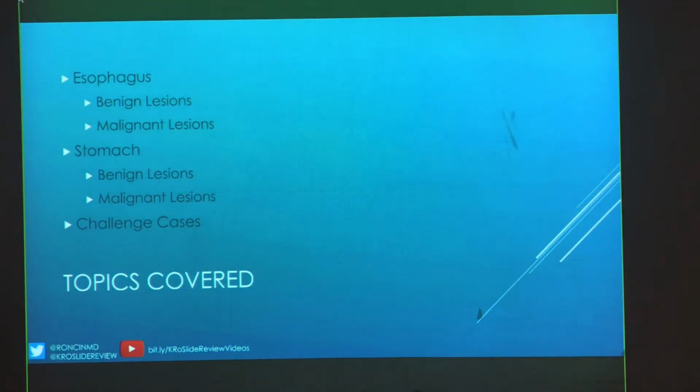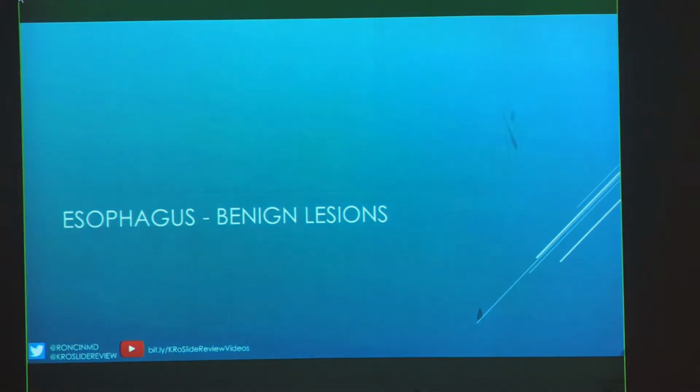Okay. So, relatively simple. We're going to have some benign lesions, some malignant lesions for both esophagus and stomach. A lot of these are entities that I myself have found challenging, so hopefully they're not quite as challenging for you guys. Let's get started.